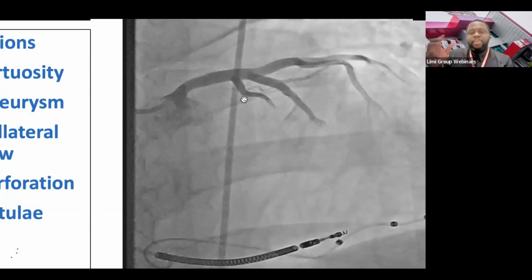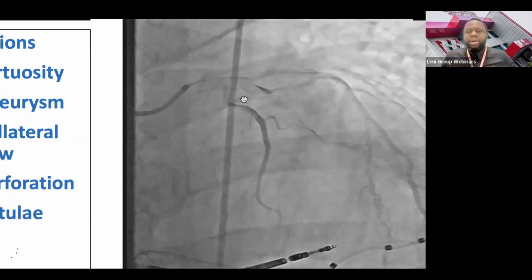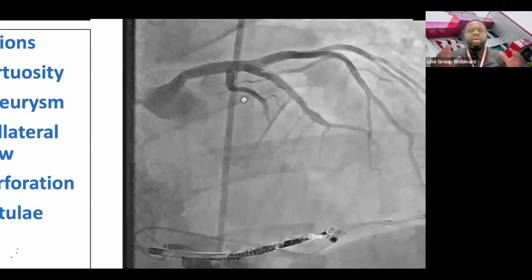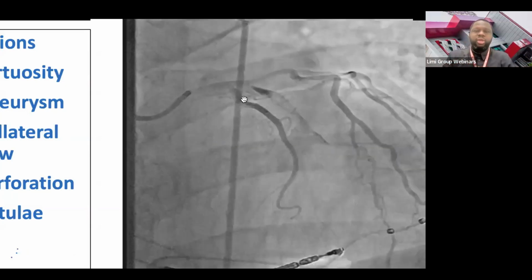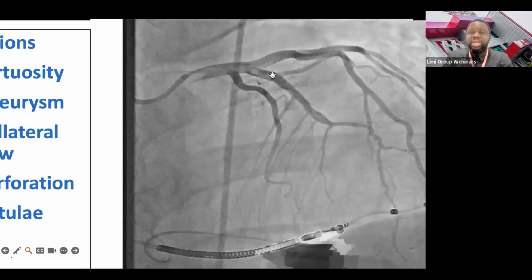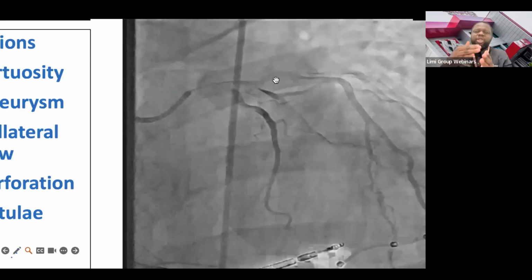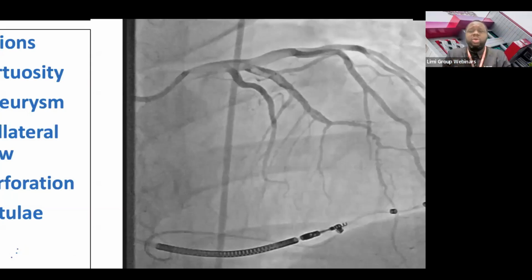In people that are either pregnant or just delivered, and typically they have no pre-existing coronary condition, as in no hypertension, no diabetes, nothing. So they will have an MI, and then you come in and you can see that there's contrast. The contrast is staying in between the intimal flap and the vessel. That is why you are seeing contrast hold up.